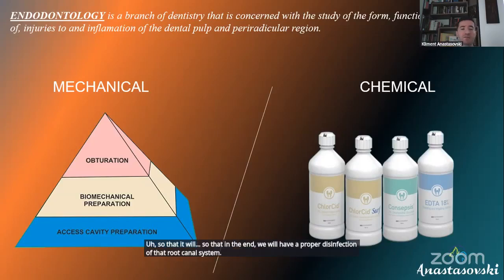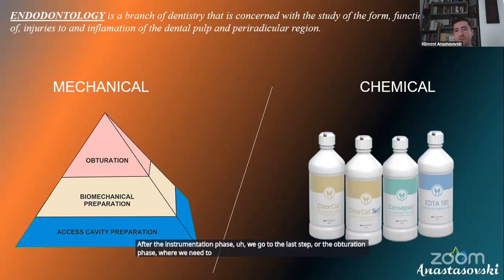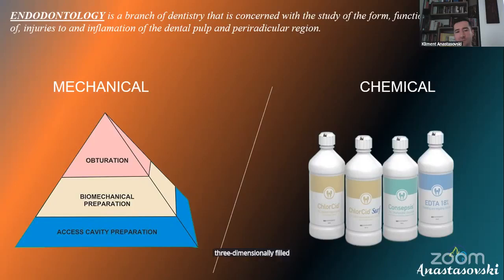After the instrumentation phase, we go to the last step, or the obturation phase, where we need to achieve a well and three-dimensionally filled root canal system.